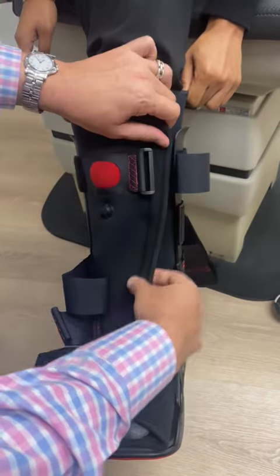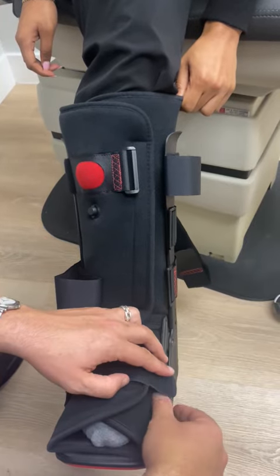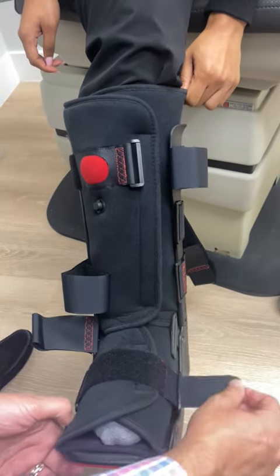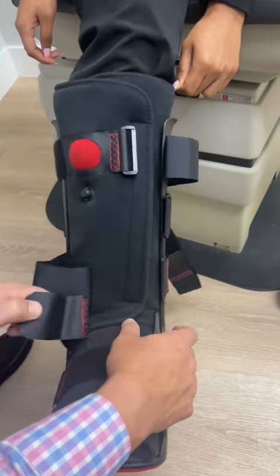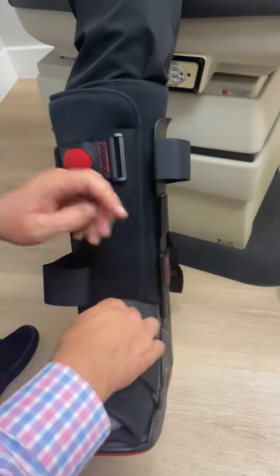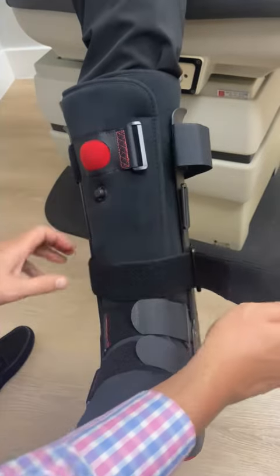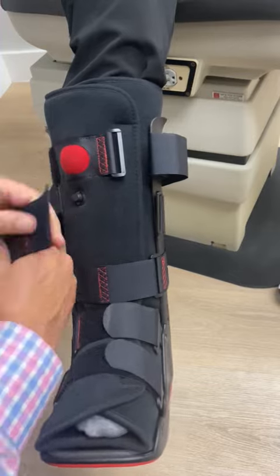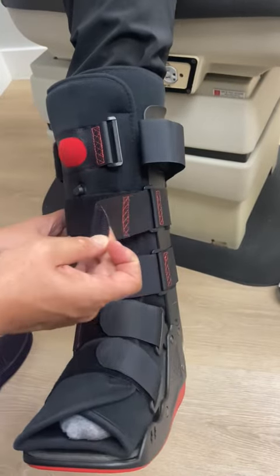Tuck this in, fold over, fold over — after that one's tucked in, tucked in — and now you just reconnect the straps. Start towards the toes and just work your way back. You don't have to go so tight as to cut off circulation, but it should be at least a little bit snug. Just keep on reconnecting the straps.